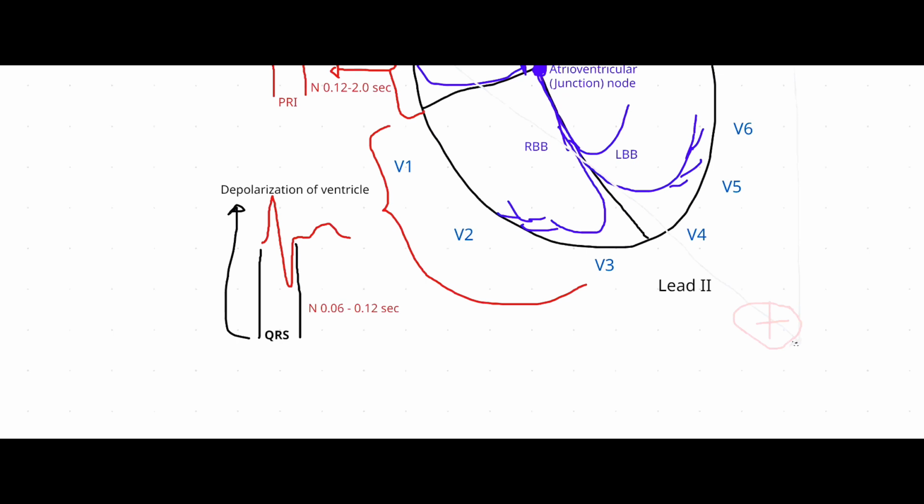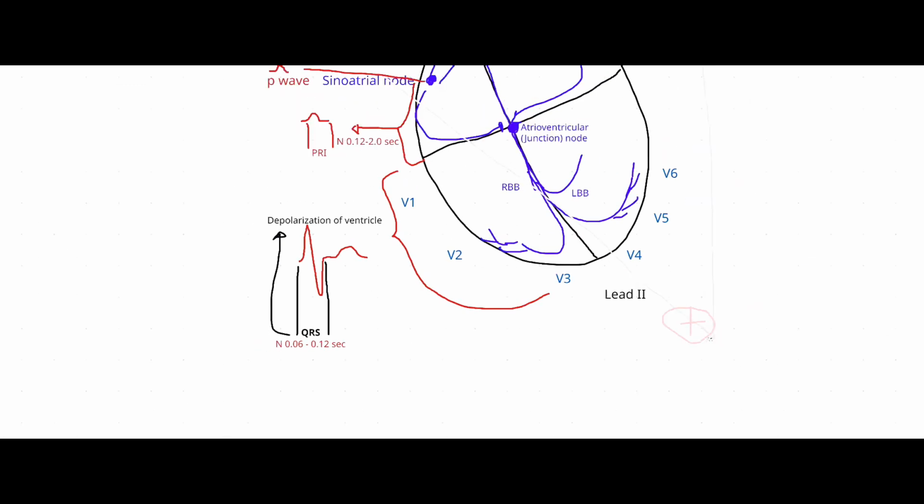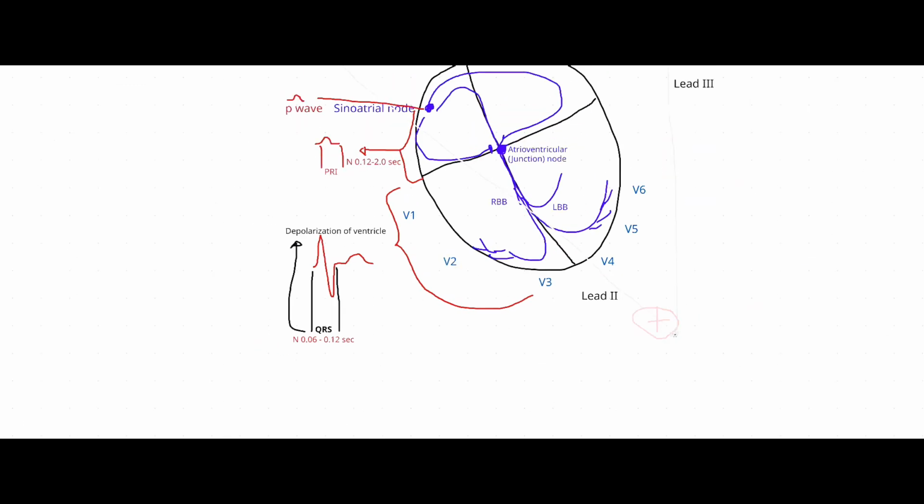All right, so that's this, right? And then, one thing that I didn't put on here yet is the baseline. So we'll put the baseline in the gray. So the baseline again is basically where this line is, right? And I mentioned to you guys that anything above that line is positive. Anything below the line is negative, okay? That will make more sense later on when I talk about the junction, hopefully.